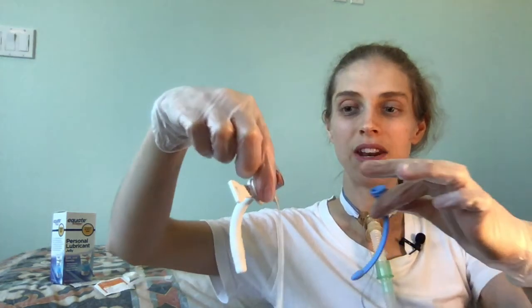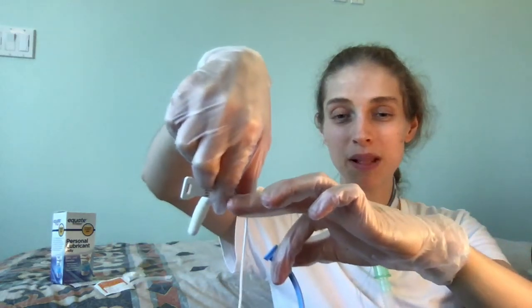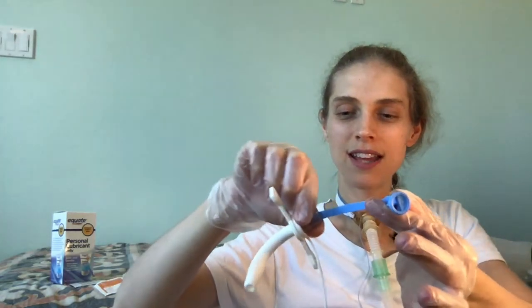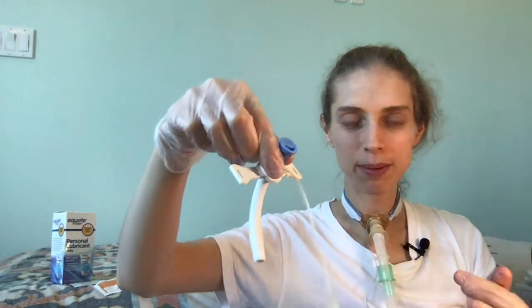And then once you have that, you're gonna wanna carefully take your tracheostomy tube. Again, only touch the tracheostomy tube by this plastic right here. Do not touch any other part of the tracheostomy tube. Once you have that, you're gonna slide the obturator in. It's gonna kind of snap into place.